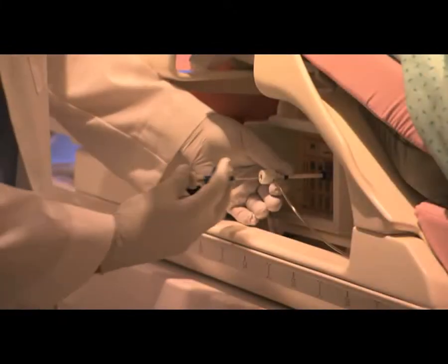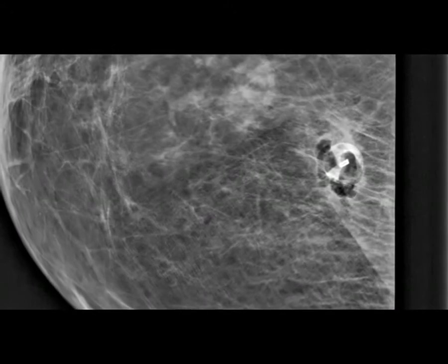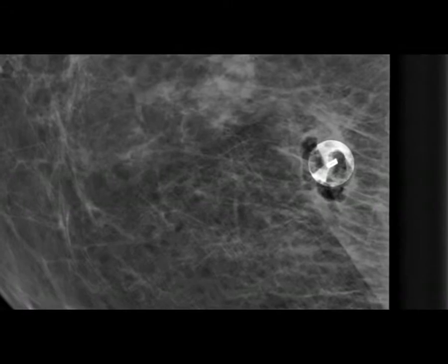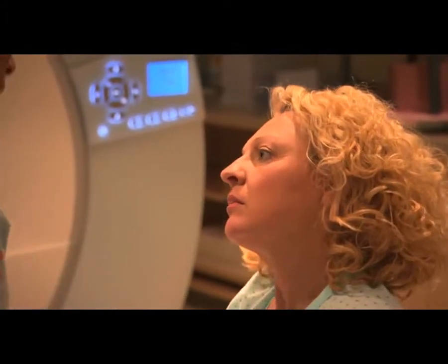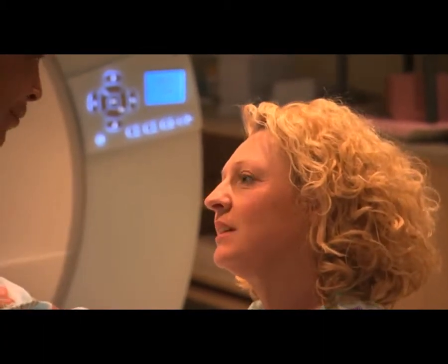Finally, a tiny marker is placed at the spot where they took the sample. This can be seen in future mammograms to show the location of this biopsy, and to minimize the chance that this location would be biopsied again. Some physicians may take an additional scan to confirm the marker's placement. Then your procedure is finished. The technologist will apply pressure for several minutes and bandage the incision in your skin.